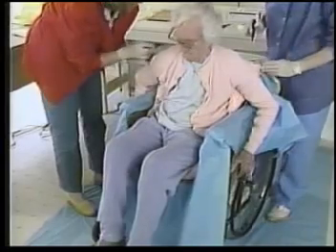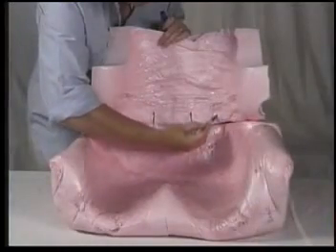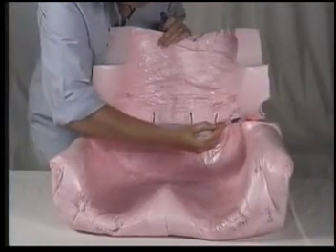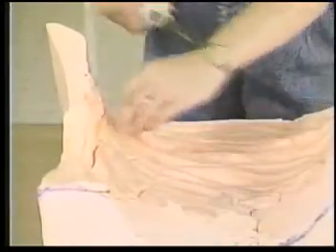Look for areas under the arm and around the shoulder that might rub and cause discomfort. Check to make sure you have adjusted the insert to accommodate seat belts or lap trays. Mark the bottom and back so the 2 pieces can be lined up after being removed from the wheelchair. The seat can now be finished without the client.